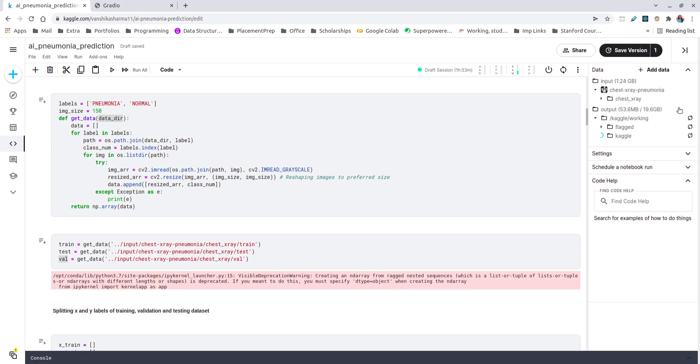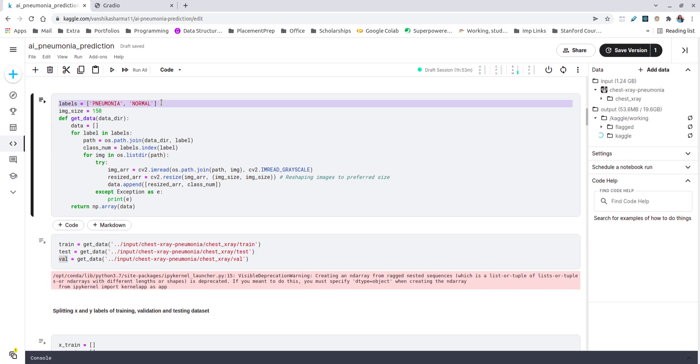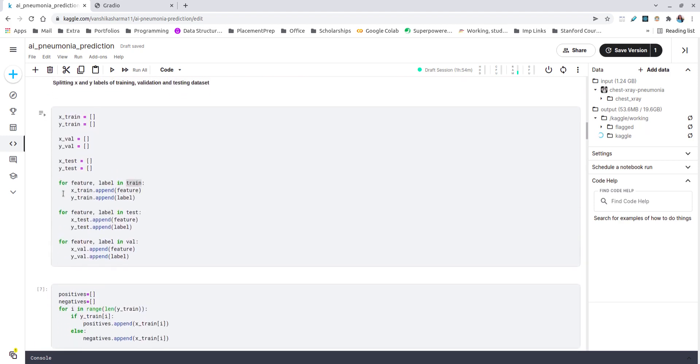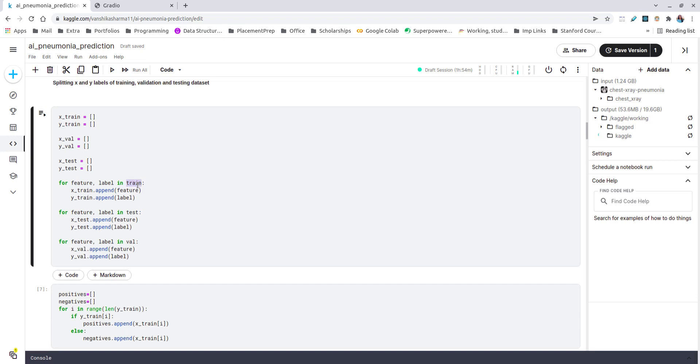In this particular cell I'm trying to get the data directories into my notebook. I've made a small list of two labels which I'm having: pneumonia and normal. I am fixing my image size to 150 pixels and defining a function get_data which takes as input a data directory and returns a NumPy array collection of my data. I'm calling this function three times: one for train dataset, testing dataset, and validation dataset. In this particular cell I'm trying to split my X and Y labels for all the three training, validation, and testing datasets.